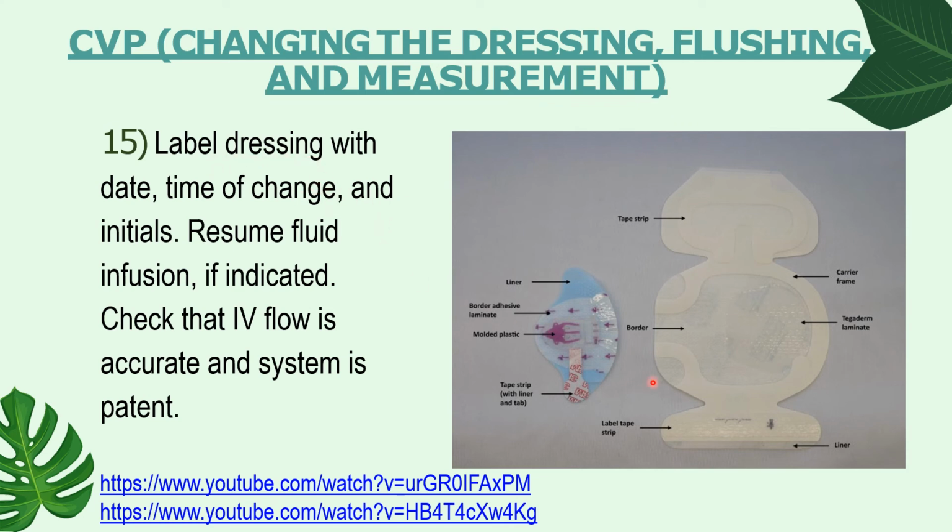Label the dressing with date, time of change, and initials. And then you can resume fluid infusion if indicated. Check that IV flow is accurate and the system is patent.